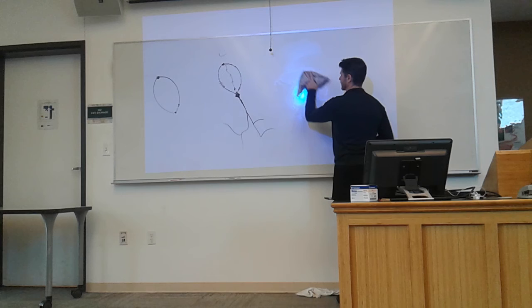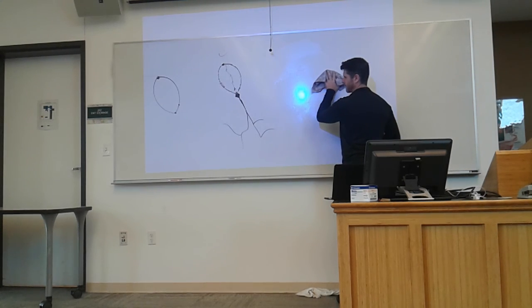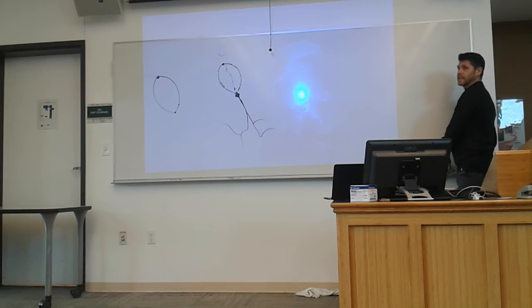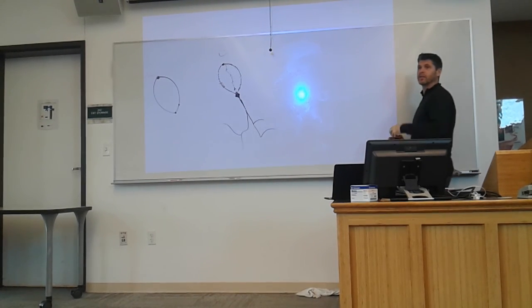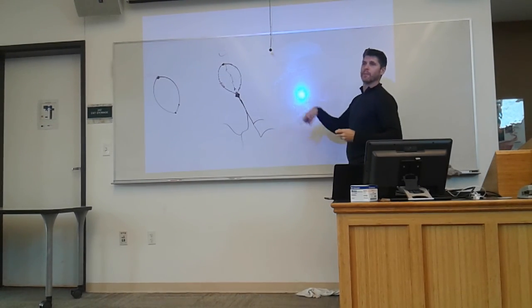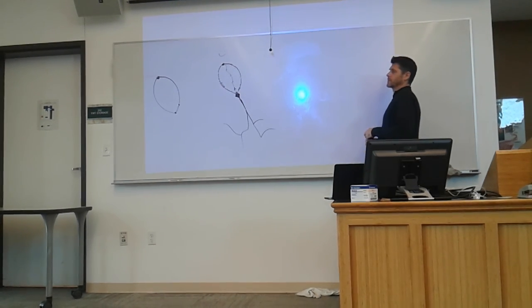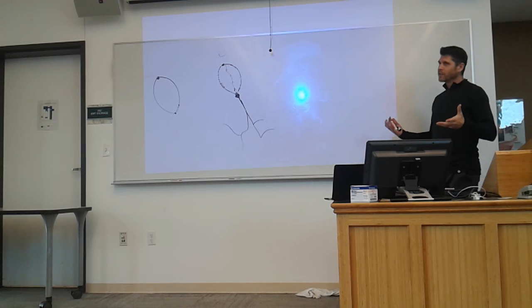Will the morphology of all the P waves in this instance be the same? Yes, the morphology tends to be the same once you get into that loop because the pathway is the same. Now, what Annalise was asking about just a minute ago is what about the AV node?